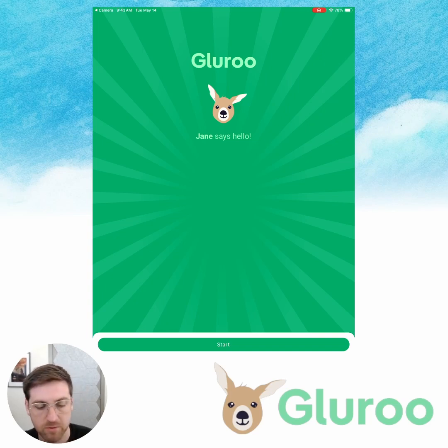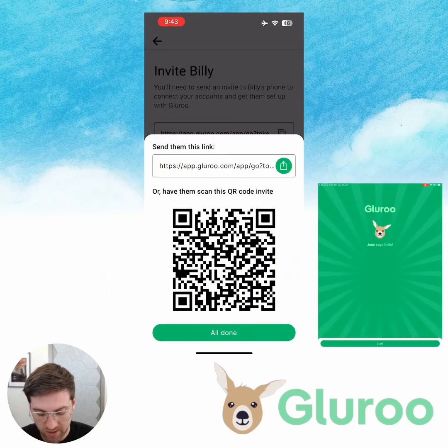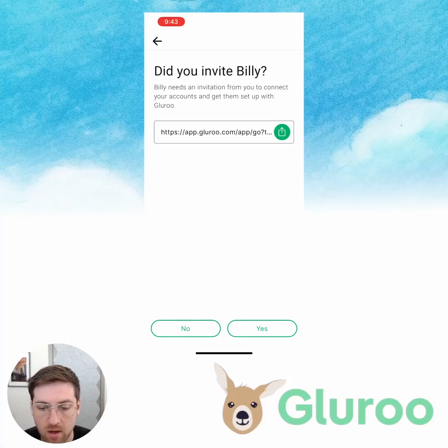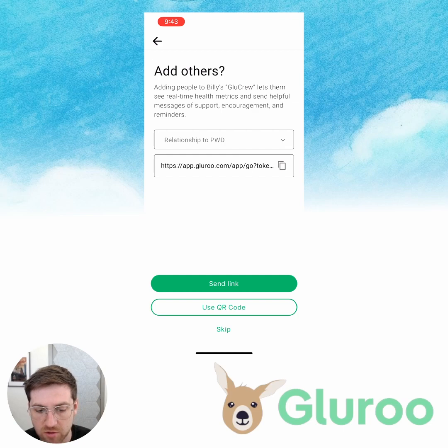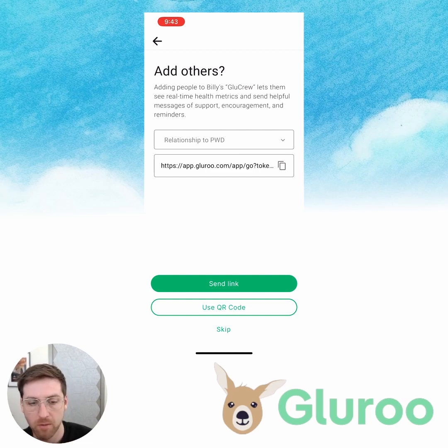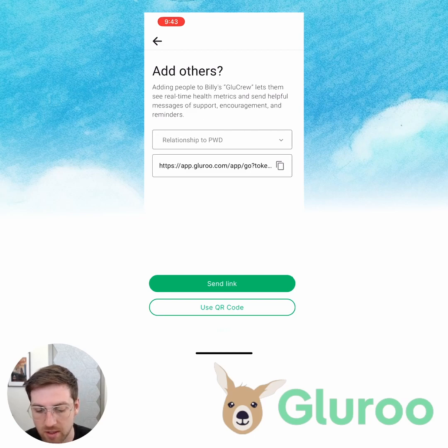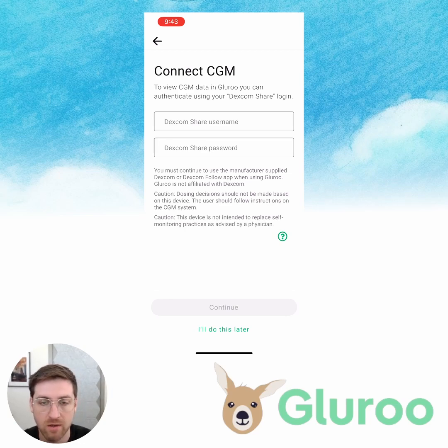GlueRoo is installed on the iPad. I get a splash screen that says 'Jane says hello.' So I'm going to put the iPad to the side for a second and go back to the iPhone. I'll confirm that I did invite Billy — he's got the invitation. On this screen I can add other people, like my partner, a babysitter, a school nurse, or whoever else is relevant for helping Billy manage his type 1 diabetes. I'm going to skip that step for now. Now to connect to CGM — I can do this on my phone on behalf of Billy because I know his Dexcom login credentials.